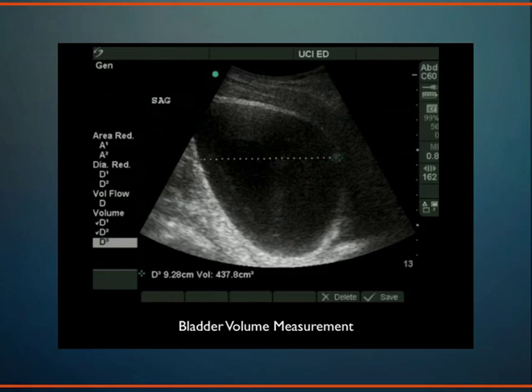But just to measure the urine, there's also something called a post-void residual. Somebody who has an enlarged prostate thinks they've emptied their bladder, but instead we have 400 cc's left in the bladder after they attempt to void. Well, their post-void residual of 400 cc's is a lot of good information to pass along to a specialist like a urologist. And we can also measure their prostate on bladder ultrasound.